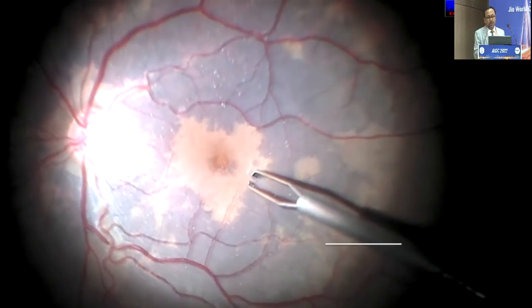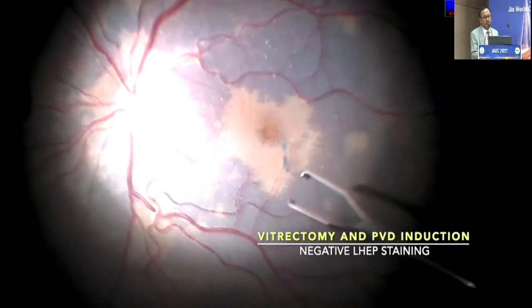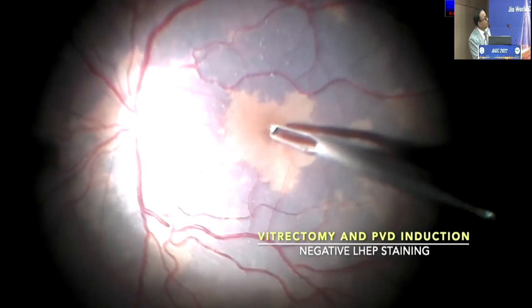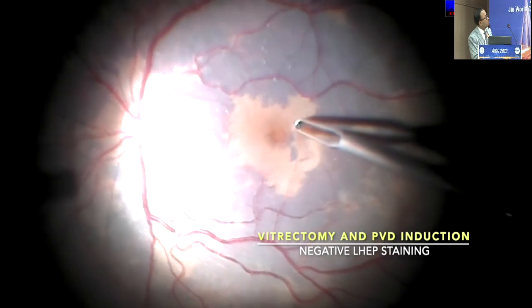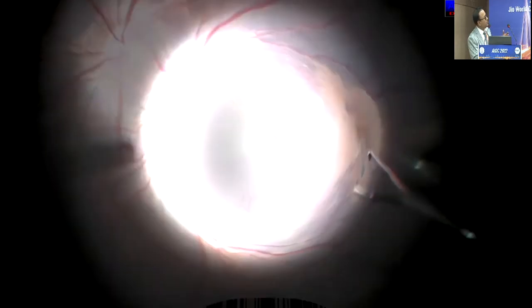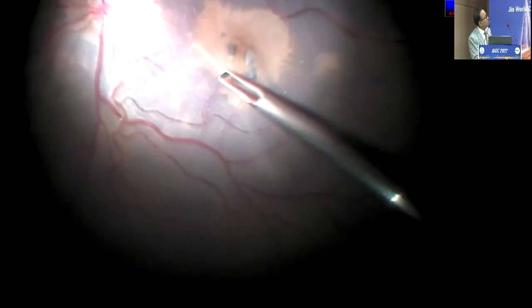So this one patient who had a flat membrane, we can see we do a vitrectomy and PVD induction, followed by brilliant blue staining. You can see here negative LHEP staining because of the membrane, and you start removing the membrane first around the ILM flap, so that you can actually get into the membrane. You make a flap of the ERM over this.